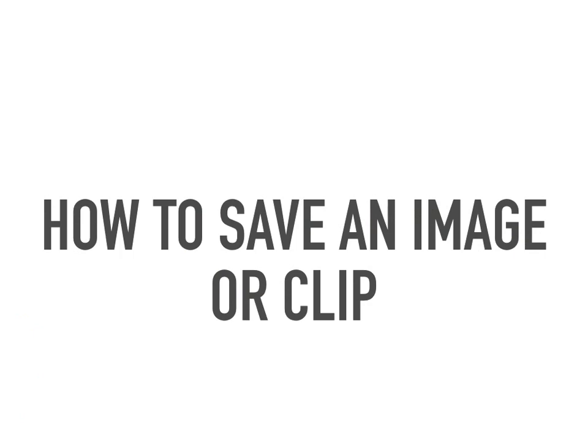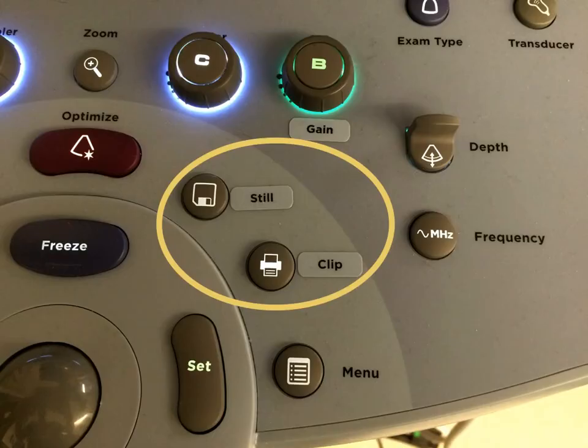Now, we went over how to save an image, but need to add on how to save a clip as well. There are really 2 ways to save an image. First, if the anatomy you're trying to image has little or no movement associated with it, you can tap the Still button as you are scanning in real time.